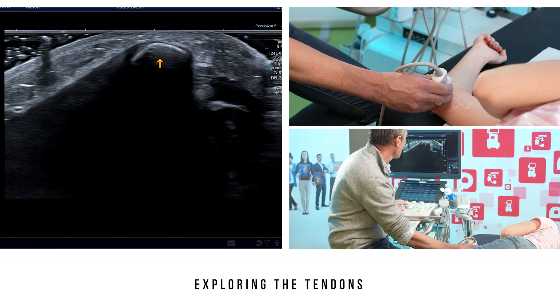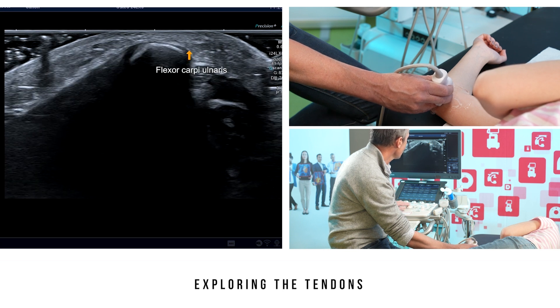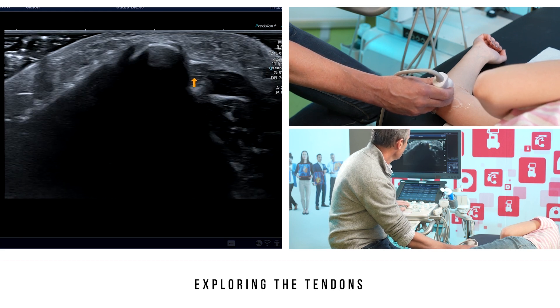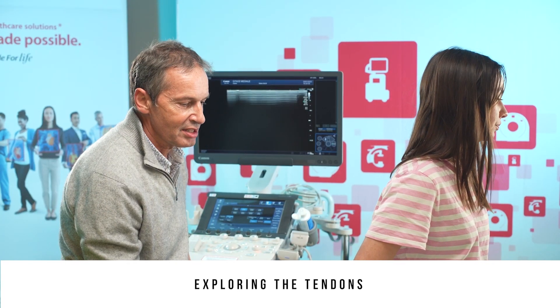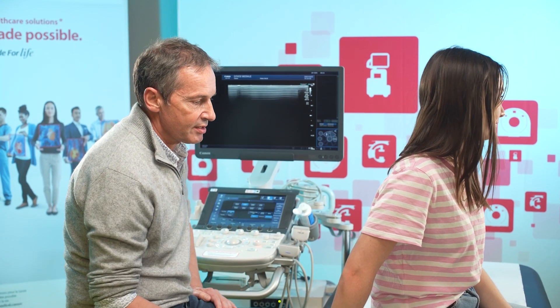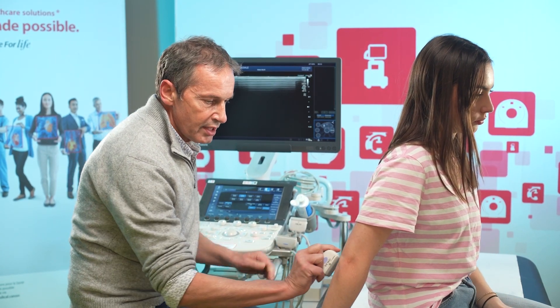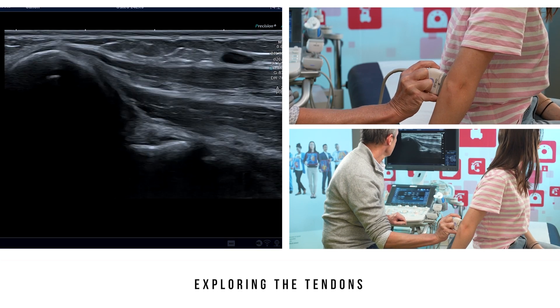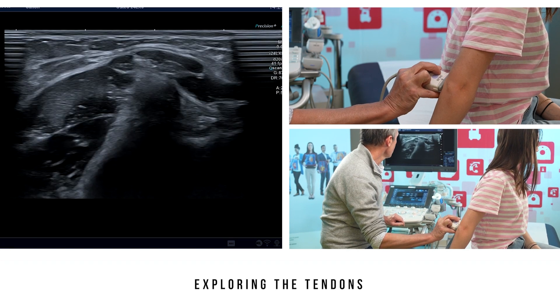Behind this tendon's insertion, the tendon of the flexor carpi ulnaris inserts behind the medial epicondyle. It is very posterior and inferior, and in close contact with the inferior portion of the cubital tunnel. To conclude the tendon exam, it is important to evaluate the tendons without compression. We ask the patients to turn their back to the operator, elbow half-flexed and forearm pronated. In this position, we can explore the medial epicondyle tendons without compression, allowing us to detect potential hyperemia in Doppler mode.